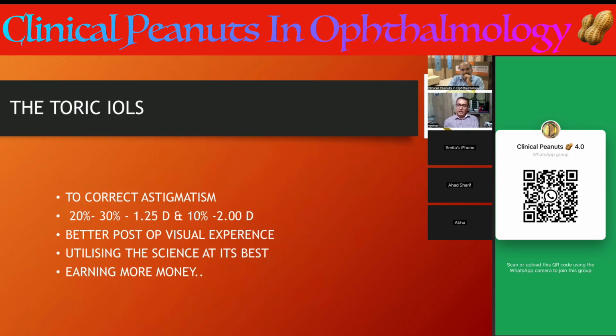I mean, in multifocal, you explain to the patient, and sometimes the patients are not happy because of unknown reasons also. And in EDOF, since the patients have slightly more than usual near vision, most of the patients complain about the near vision. So unlike those, with toric IOL you will always have a happy patient if you have implanted well.